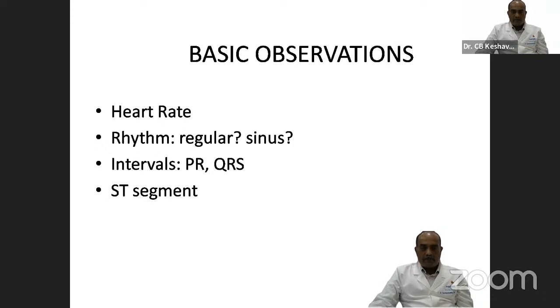So the basic observations, we start with the heart rate, rhythm, whether it is regular, whether the rhythm is arising from the sinus or not arising from the sinus, which makes a big difference for us in treatment.